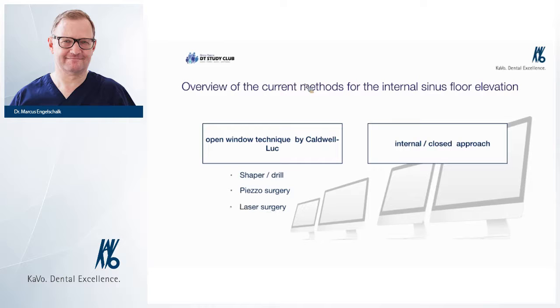You see, well, there's bone in the height, but you don't know if it is deep enough. And if you place your implant and it's just covered half by bone and the rest is the sinus floor, you will never see it on the two-dimensional X-ray. So it's very important to elevate the whole sinus you want.